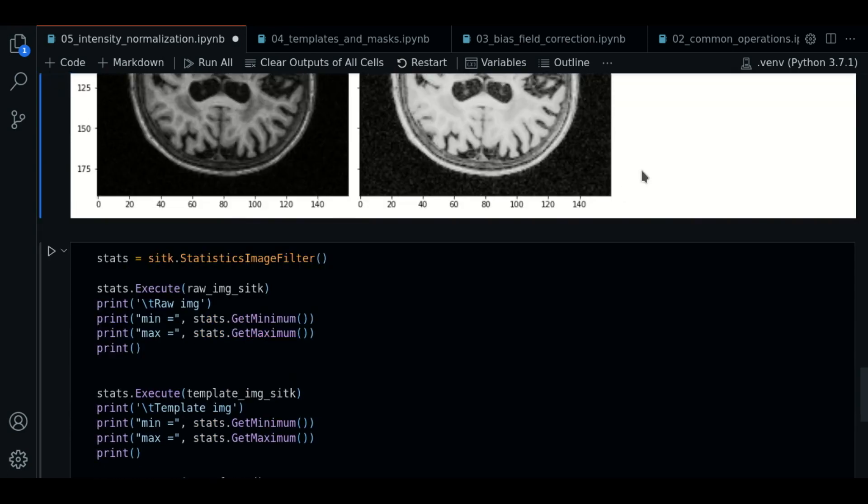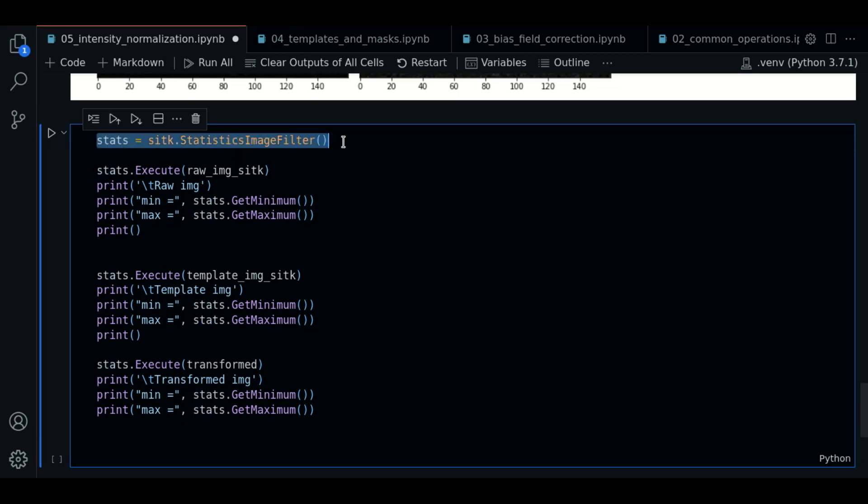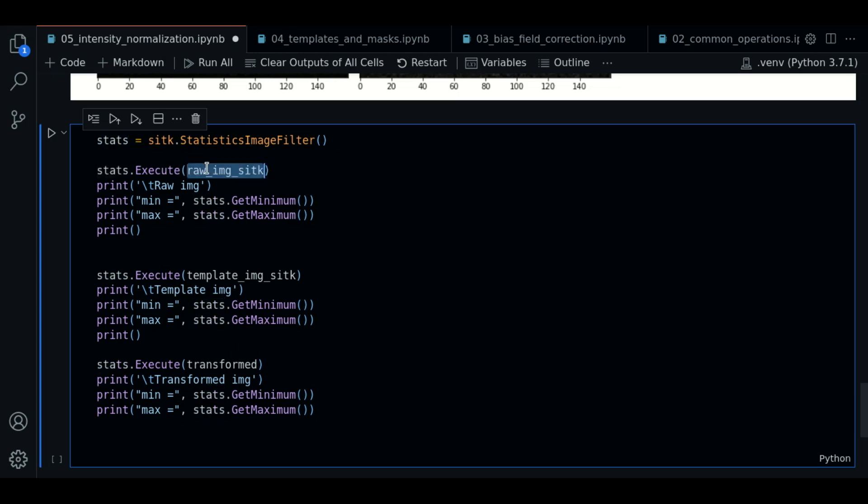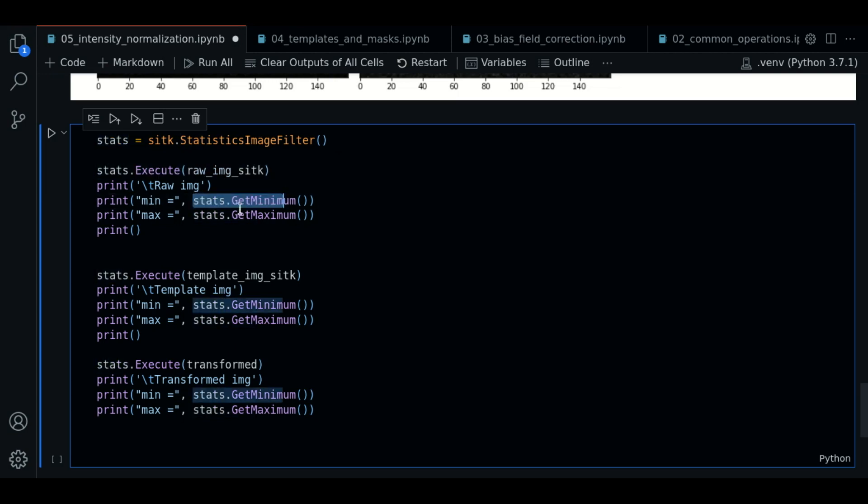So besides these visual changes, let's compute the statistics and compare to see the effect in the intensity values. We use the statistics filters we know. We create an instance and we execute it with the raw image.